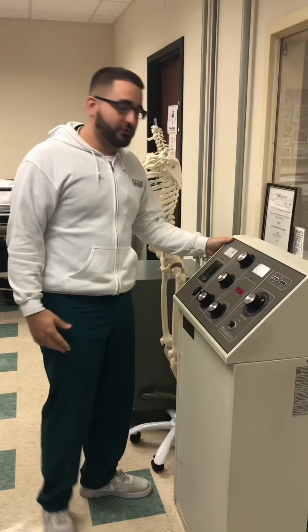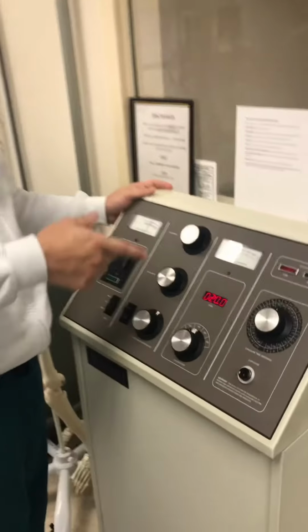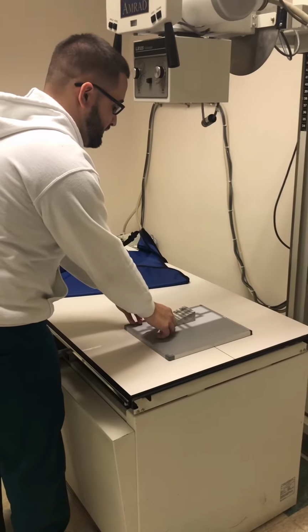So as you guys know, low contrast is obtained by using high kVp. A tool that we're going to use today to determine the effectiveness of kVp in contrast is a penetrometer. It's an aluminum step wedge with different thickness. So to determine the low contrast, I'm first going to use 80 kVp with 20 mAs. I'm going to position the penetrometer here.